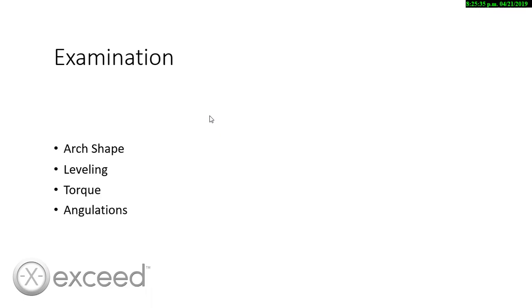After we verify how the technician solved the crowding, the AP relationship, the spacing, deep bite, open bite, or any other condition, we are going to check the arch shape, the leveling, the torque, and the angulations.